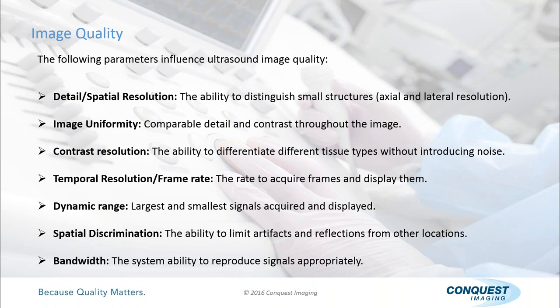Temporal resolution, frame rate. This is simply the rate to acquire a frame and display it. So this is where you build your image from top to bottom, and as you do so, how long does it take you to do that? And we'll again define that in greater detail in a little while.